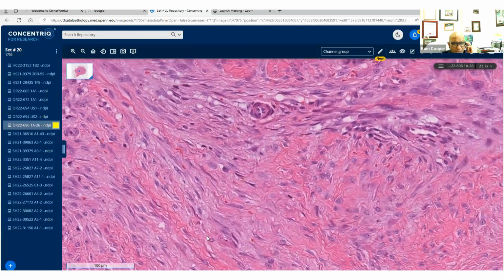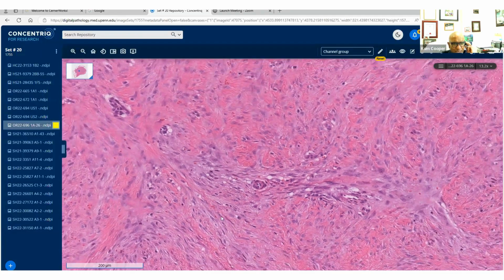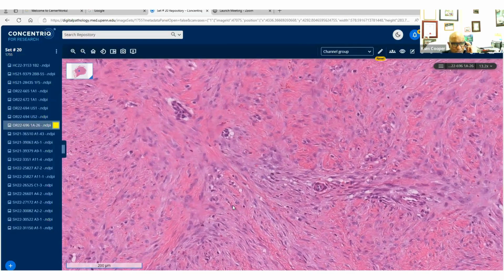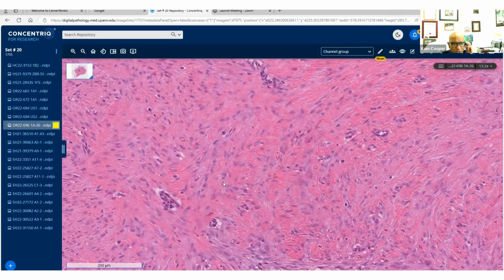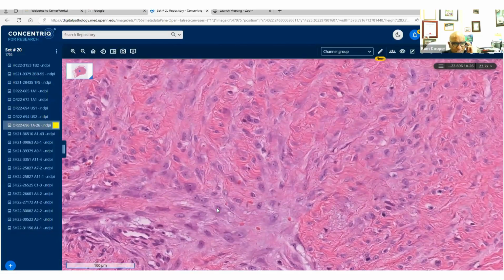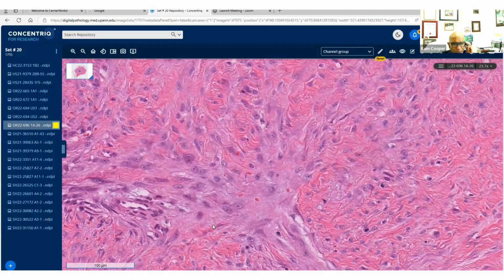And sometimes, like Dr. Who mentioned, you get this edema around vessels. You can get tumors that have a nodular fasciitis appearance as well. And they can have hyalinizing stroma, plump nuclei, and edema as well. So that's the big differential. And in fact, we're dealing with one that has that kind of morphology. And in fact, it's beta-catenin positive as well.